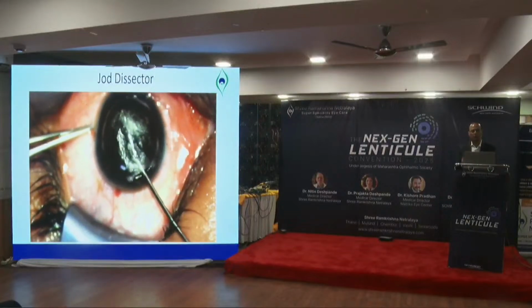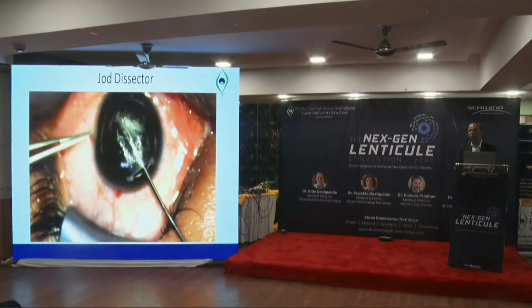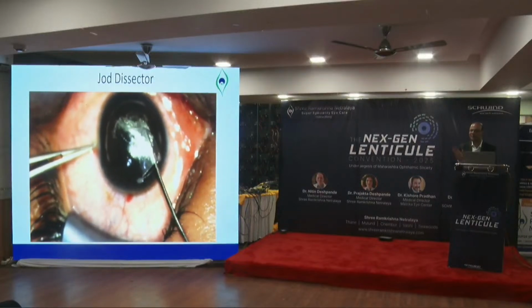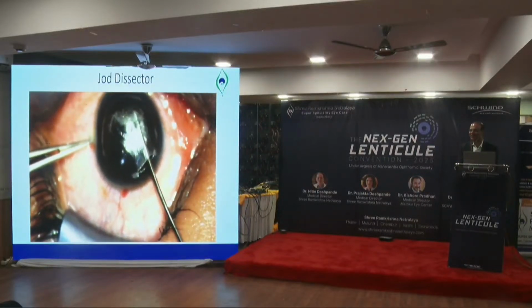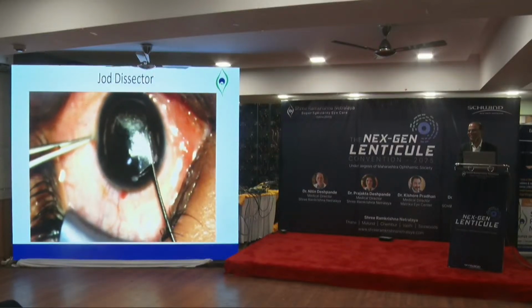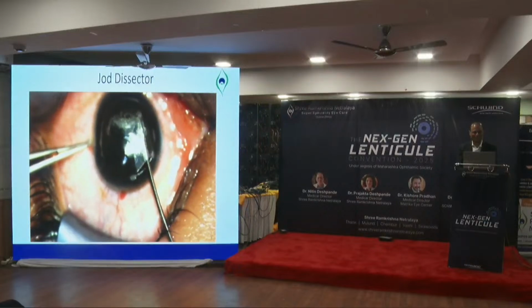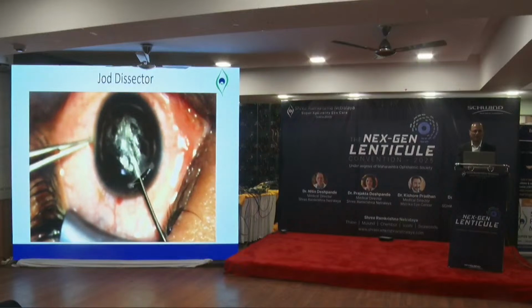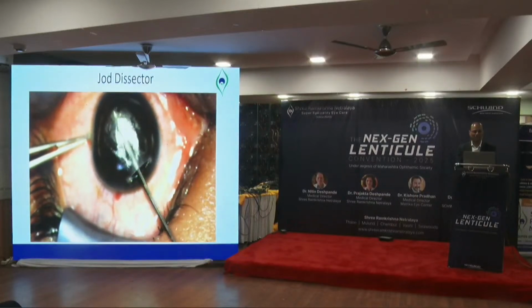Dr. Kishore showed me a very good topography-based way to detect a retained lenticule in one of the cases. When he was here, I did everything. So after he went, I was okay doing everything. When he was here, I took a chance of doing everything, all the complications. So you peel and you are done.